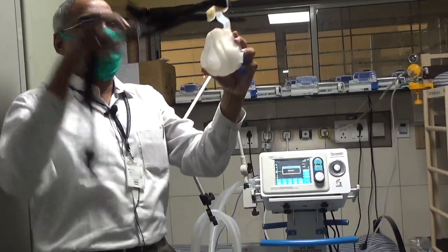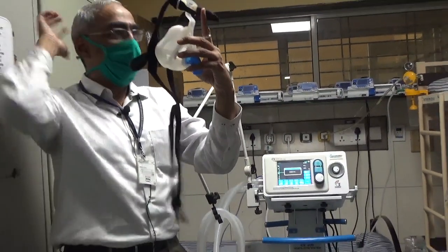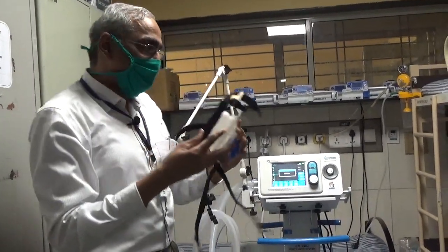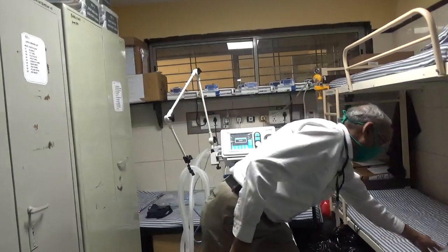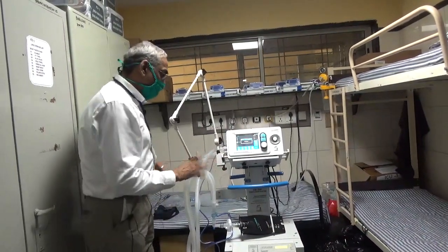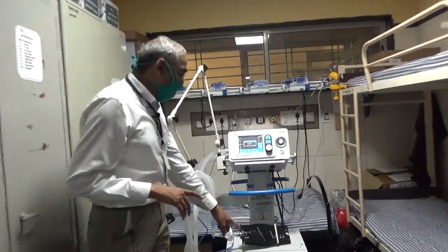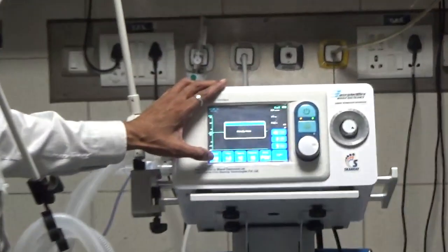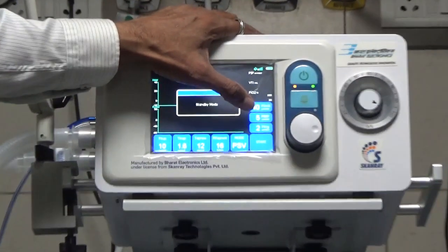Now, once the mask is placed, yeah, these upper straps tighten here and these lower straps tighten behind. Okay, I'm going to show it to you again when we start the ventilator. Okay, so you've got the mask ready now. Now what you're going to do is, with the test lung in place, you're going to make the settings for pressure support. So here you can see that pressure support is set at 10 and PEEP is set at 5.